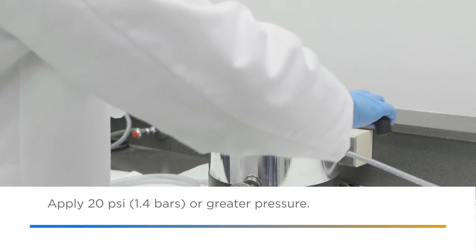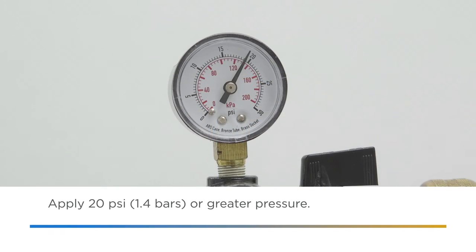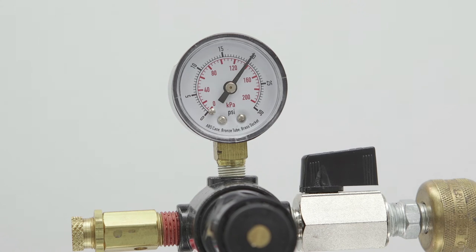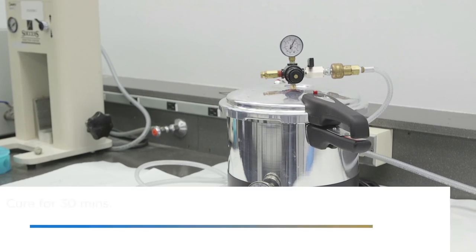Immediately close the pressure pot and apply 20 PSI or 1.4 bars or greater pressure. Do not delay in applying pressure as that may introduce porosity. Cure for 30 minutes.